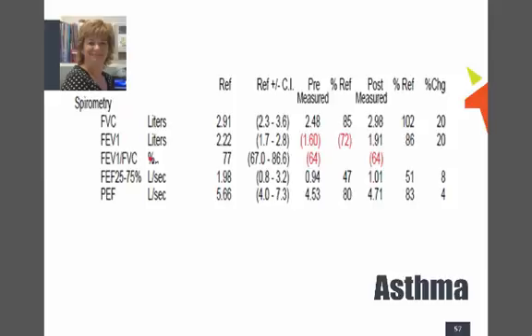That's really good. So where's our pre and post here? Okay, so here we've done one before. So before is 1 litre 600 mils, and after is 1 litre 900 mils. That's 300 mils, so you've got to subtract that from that. And it's telling you, it does the calculation for you. You can't sort of work out the percentages because it takes into account other factors. And that's 20%, so that's more than 12.